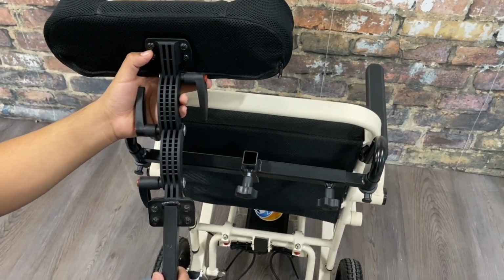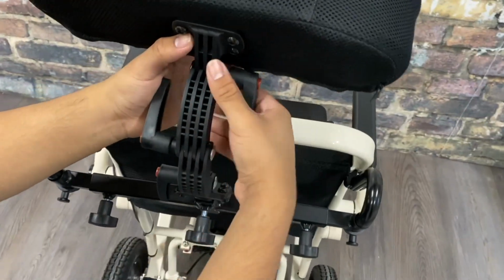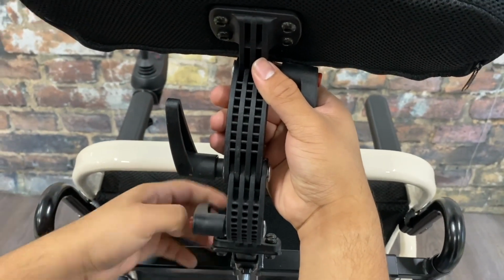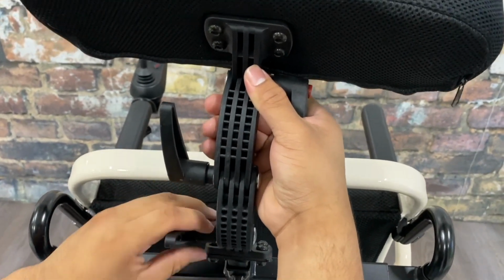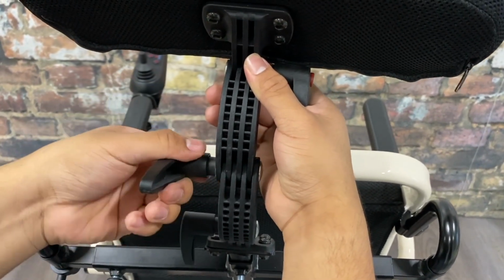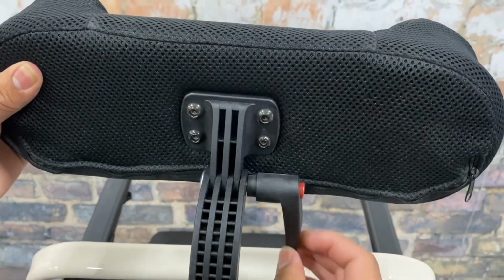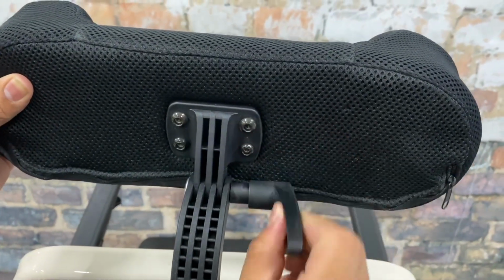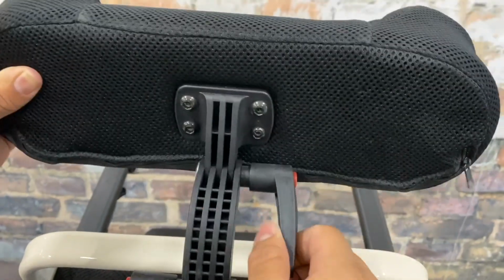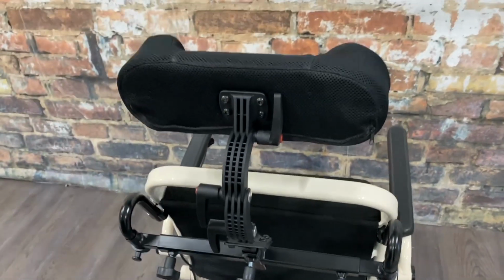The last step is to slide in the padded headrest piece itself into the middle bracket on the support brace. Start at the bottom to tighten up each lever. Righty-tighty, lefty-loosey. If you ever need to reposition those levers because they bump into each other or the chair, just simply pull the lever out, reposition it, push it back in, and tighten it. So you'll pull it out, reposition, and then it's like a ratchet system. You will tighten to put the headrest in the exact angles and dimensions that you want.